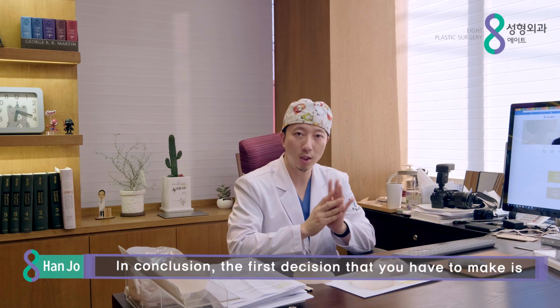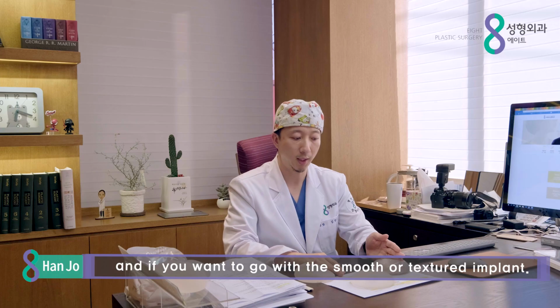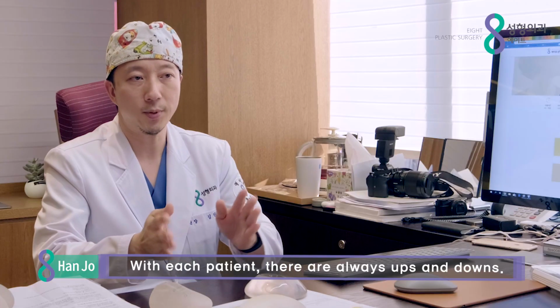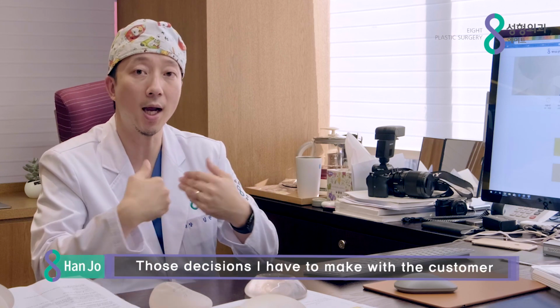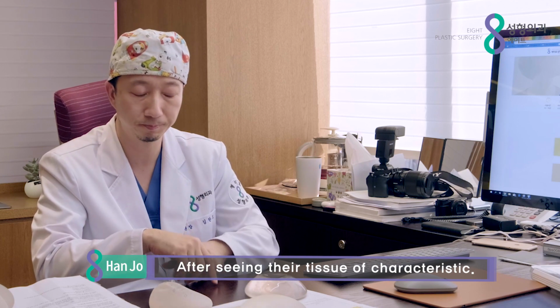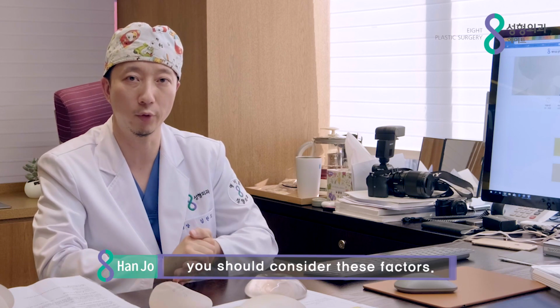So the first decision that you have to make is whether you want to go with shape or softness, and if you want to go with a smooth type implant or a textured type implant. With each patient, there's always ups and downs. In some patients, a round implant will suffice. In some patients, an anatomic implant might be better. And so those are the decisions that I have to make with a patient coming in after seeing her tissue characteristics. But just for your understanding, before you come to our clinic, those are the decisions that the patient should think about before surgery.